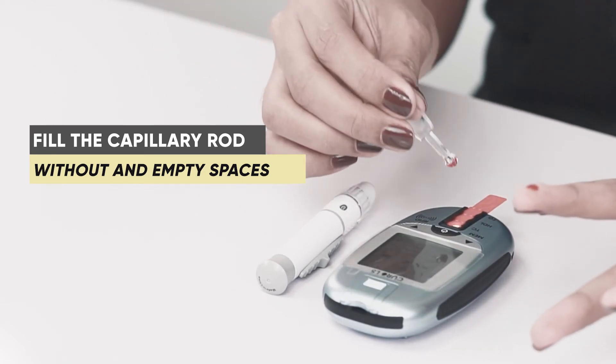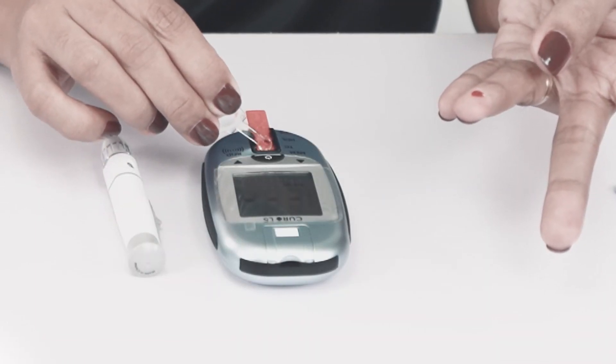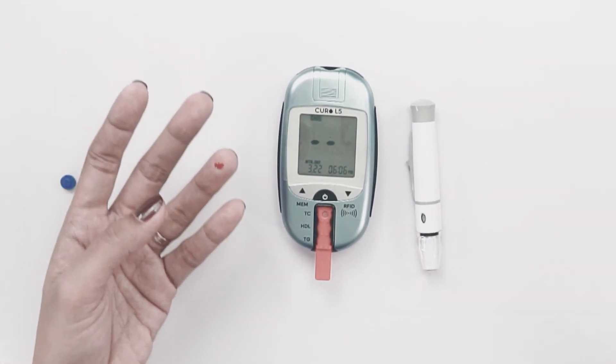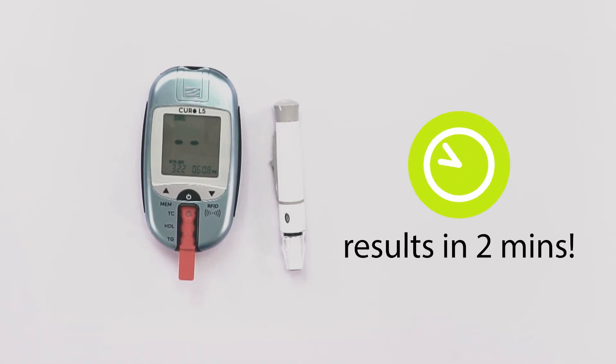Then place the capillary rod with the blood sample at a 45 degree angle. Do not remove the capillary rod until you hear a beep, and you will get the result in 2 minutes.